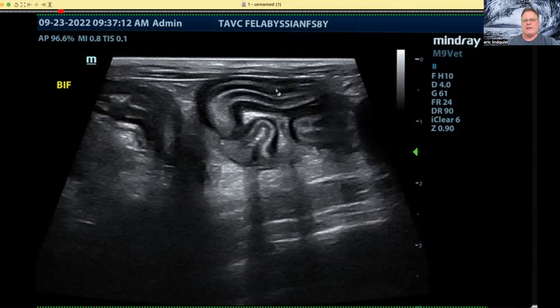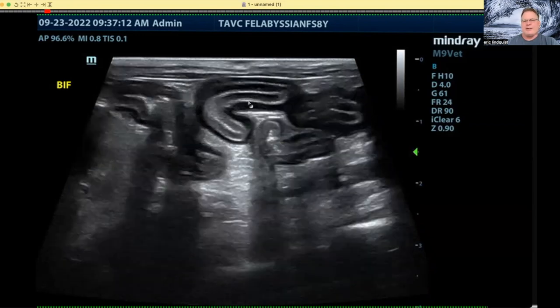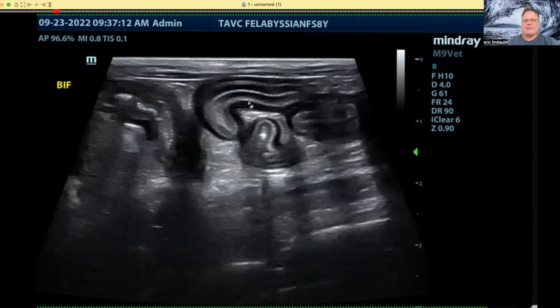In portions of this intestine, we have a one-to-one muscularis-to-mucosal ratio, which should be about one to three, because the muscularis should be thin. You can see it's diffusely thickened here, but we still have proper layering, and therefore neoplastic criteria is not present.